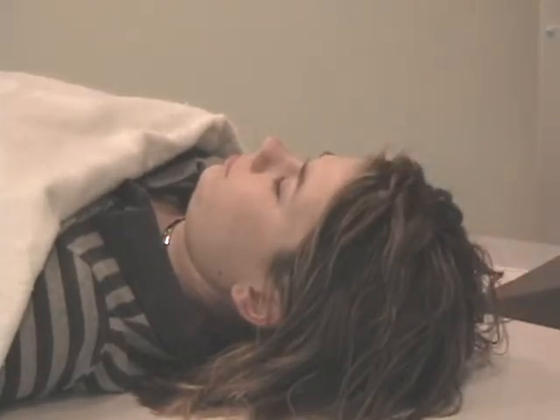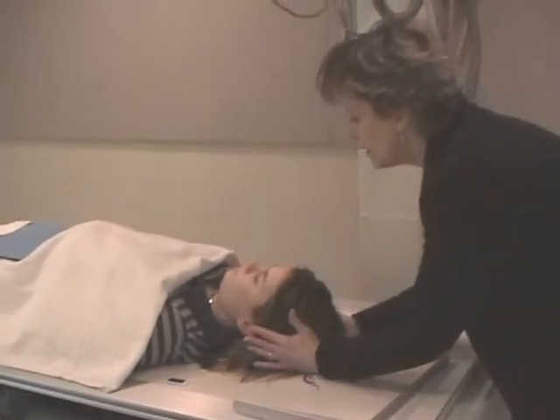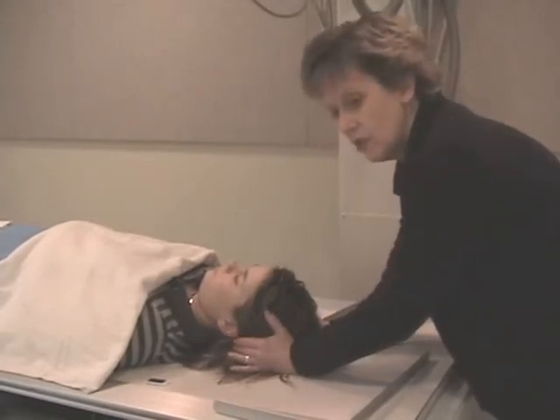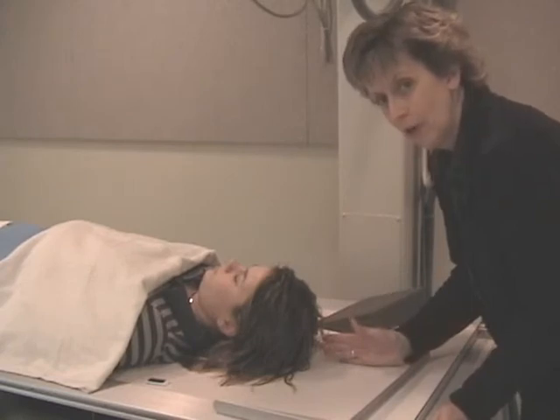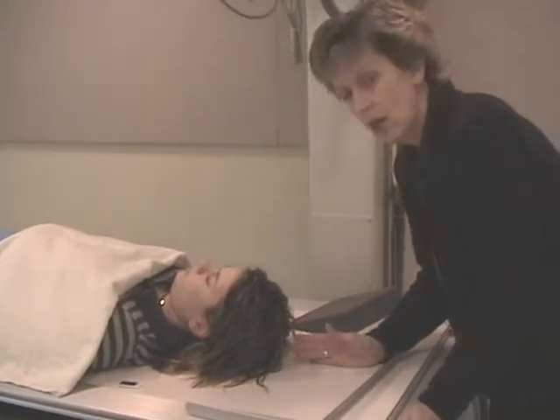The last thing you need to do is make sure there's no rotation. And I'm looking at the MSP. It serves as a centering reference line and it serves as a positioning criteria line in that the mid-sagittal plane needs to be perpendicular. It needs to be straight up and down. I'm going to let the camera realign its position right now so I can better explain that concept to you.